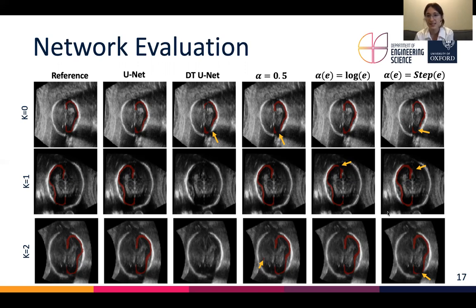Across some of the other data sets, we can see large holes in the masks, in the cortex labels, which don't correspond to a high dice loss, but can cause topology errors when looking at the cortical surface. So they really need to be avoided.